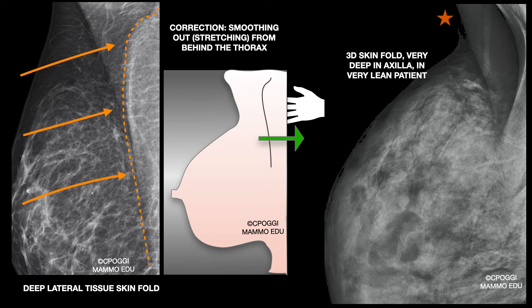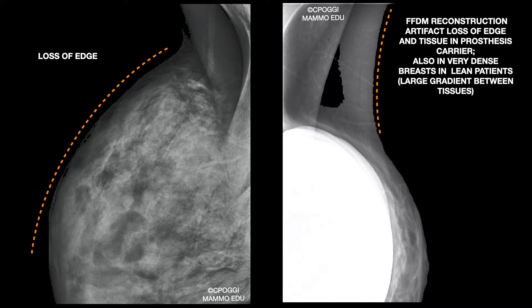If the patient is very lean but the breast is big and very dense, in addition to an important 3D fold, you could also see another artifact shown here by the stars. The artifact implies a loss of the skin edge. It is easy to see when there is an important thickness and density gradient — as happens in a very lean patient with a very dense breast, or in a prosthesis carrier. Here there is a loss of inner tissue too, for the same reason.